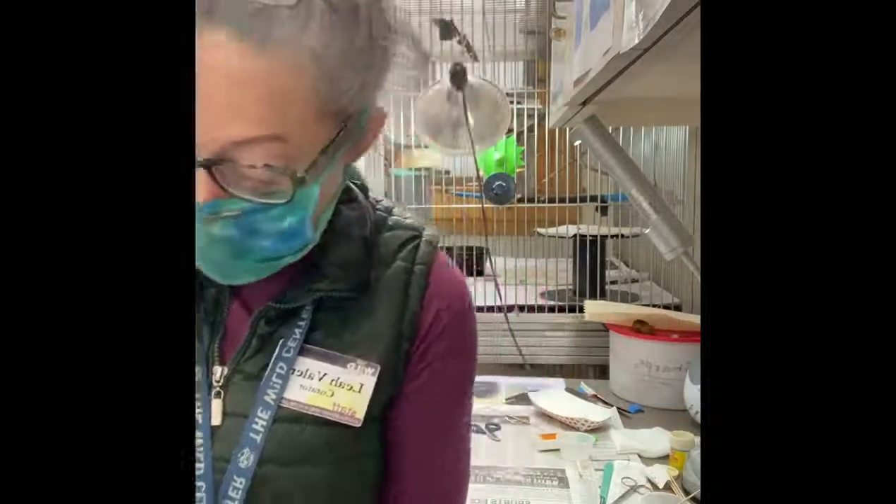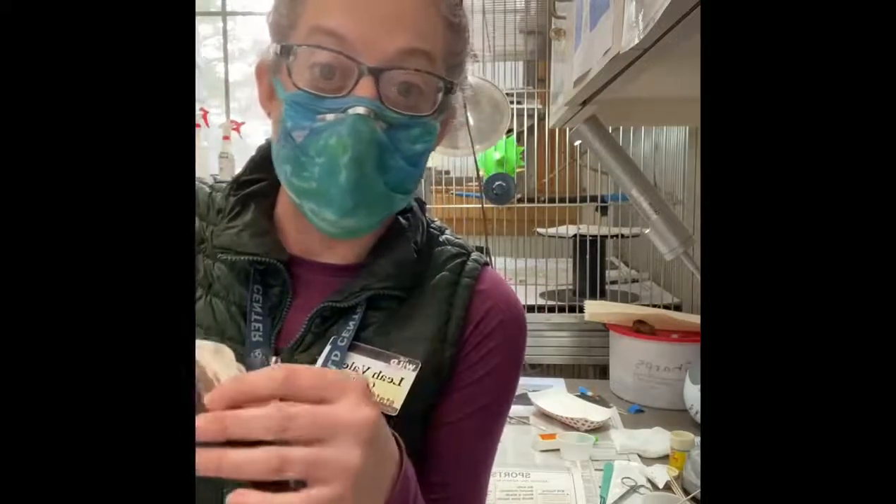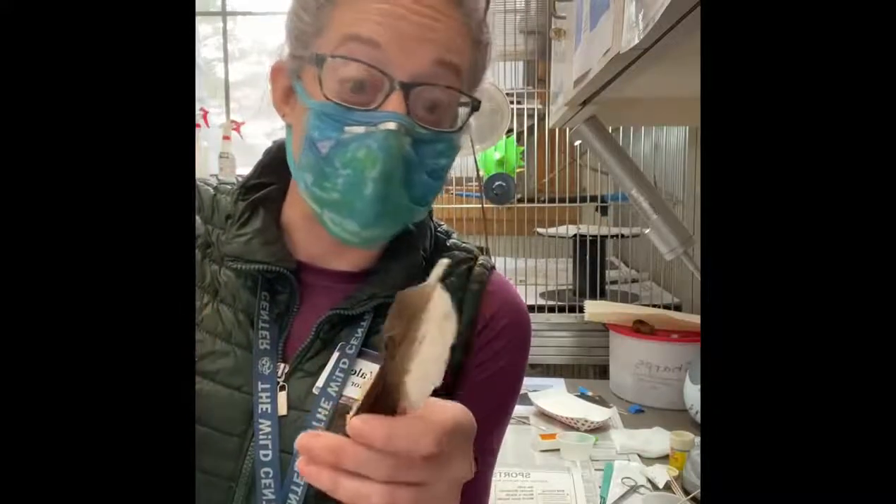What we're going to do today is try to form a new upper beak tip for her. Right now she has a little bit of trouble eating — she's eating certain things she can pick up, but she's missing a lot of the preferred seeds, fruits, and veggies we'd like her to eat. We want her to be able to eat easier. What I have done is collected feathers from our stash — birds here at the Wild Center drop their feathers periodically and grow new ones.